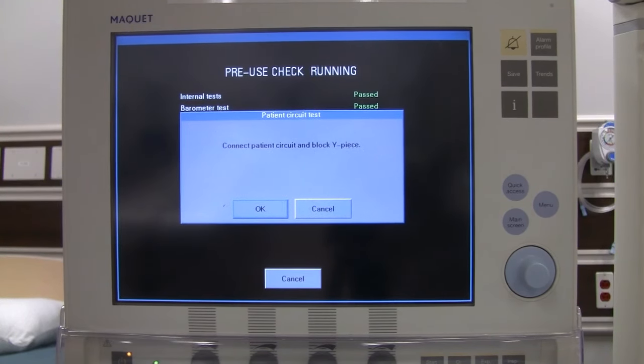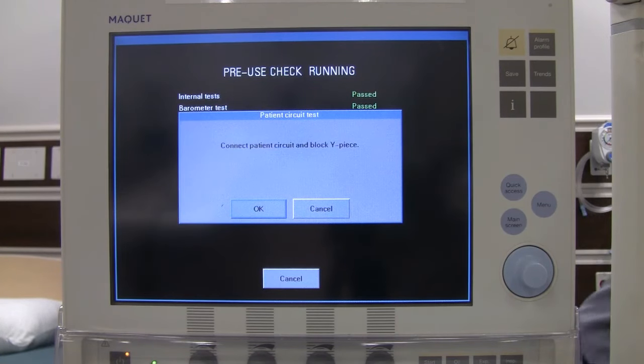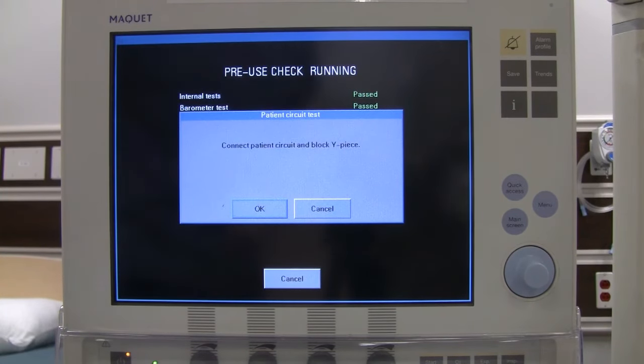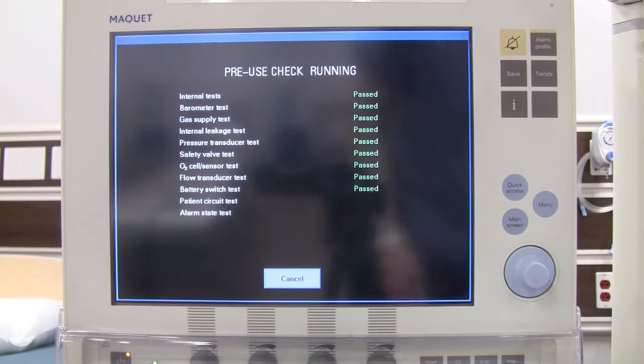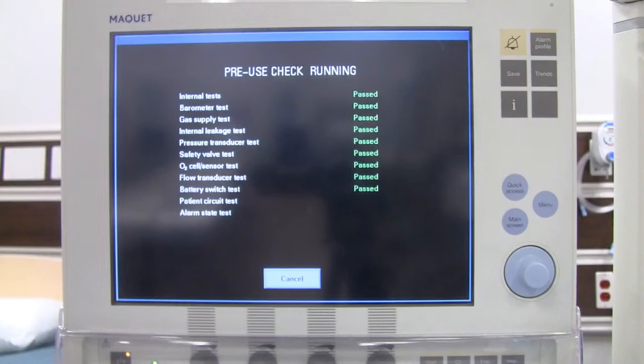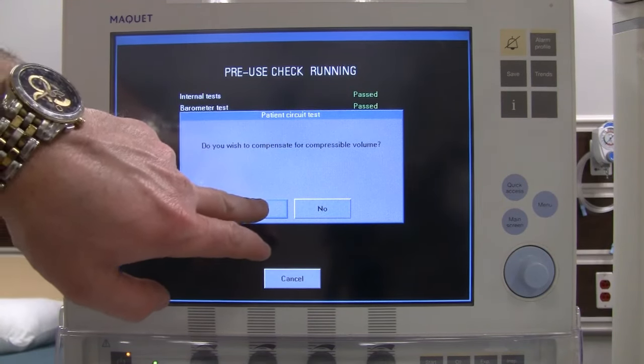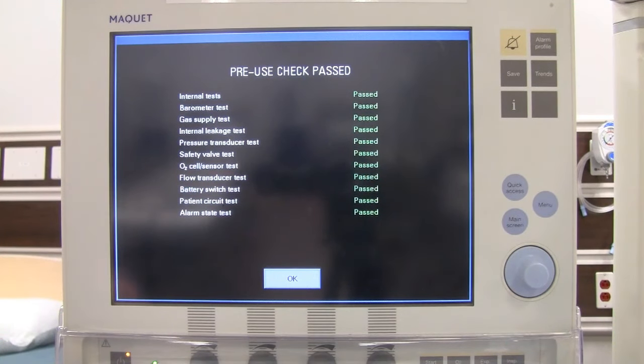Next it wants you to connect the patient circuit. Remove the test tube, grab the patient circuit, and connect to the expiratory and inspiratory outlet and inlet. Block the Y piece so it is all sealed off, then say OK. It will ask if you want to compensate for compressible volume — we always want to do this to get accurate compliance and resistance readings. Once we've passed everything, say OK.